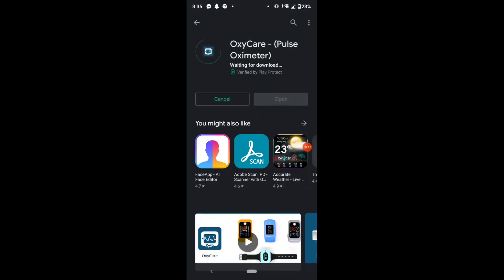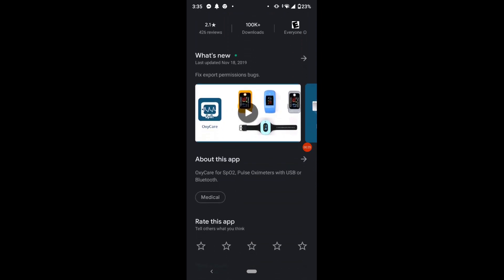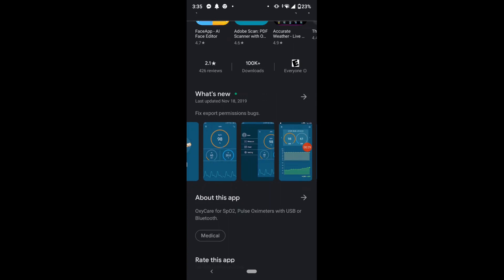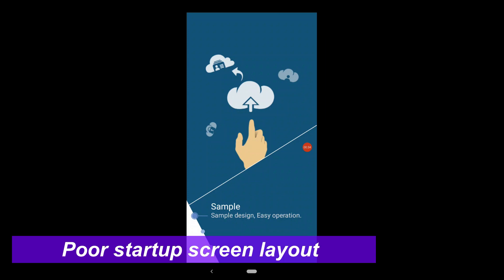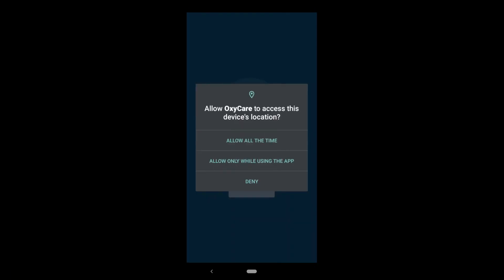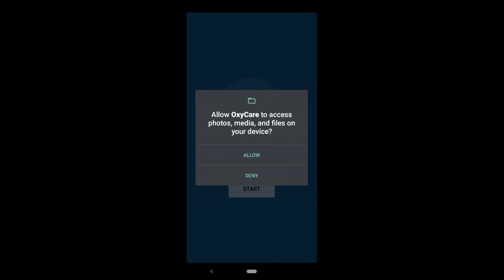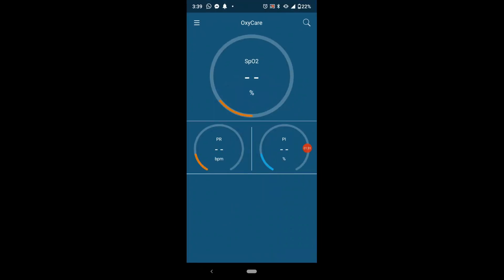The OxyCare app is written with a capital O and a capital C, despite being one word, along with the word 'pulse oximeter' in brackets. The startup screen does not have any start button — you have to side-scroll or side-slide until you come across the start button. The app fires up with three round circles with SPO2, PI, and PR written on them.